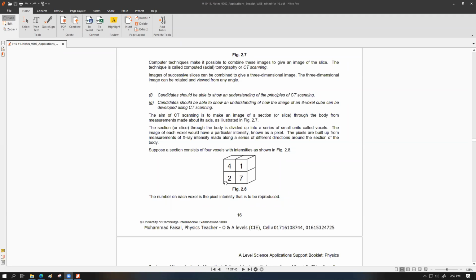I know these words are not very understandable, but I'll make it understandable to you. Just bear with me. So with the first scan, let's say the 0 number scan, the very primary scan, we build up the ground information with which we're going to work for the CT scan.